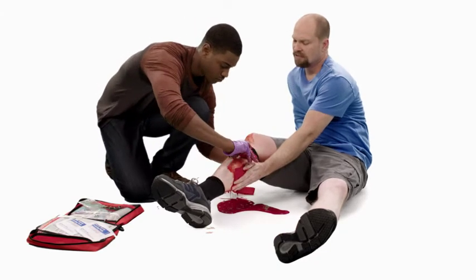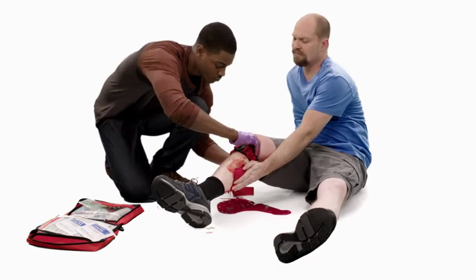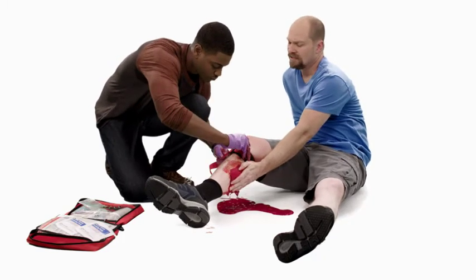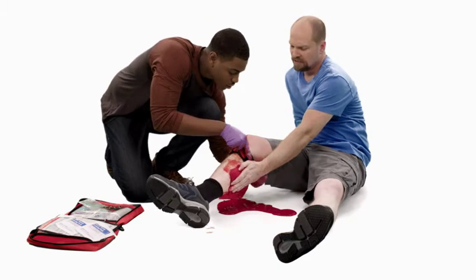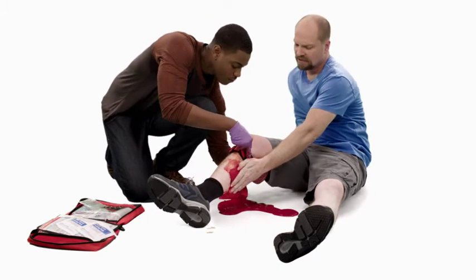Tighten the tourniquet by twisting the rod until the flow of bright red blood stops. Then, secure the rod in place using the clip or holder.